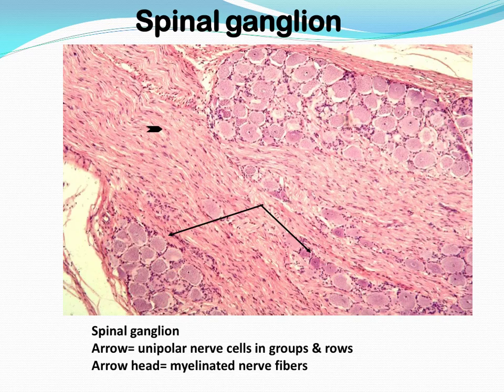They are very evident in the picture. Also, if you are asked for 3 reasons, you can add that the cells are more or less rounded, meaning that they are unipolar cells. So, the arrangement and the size and the shape.